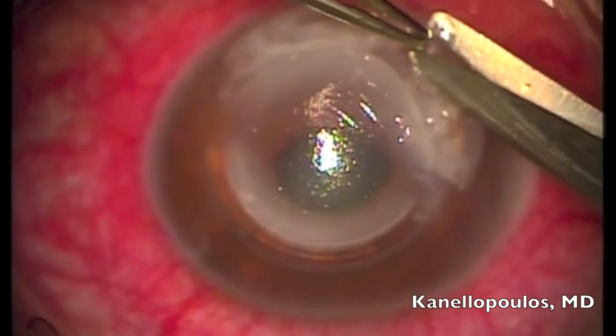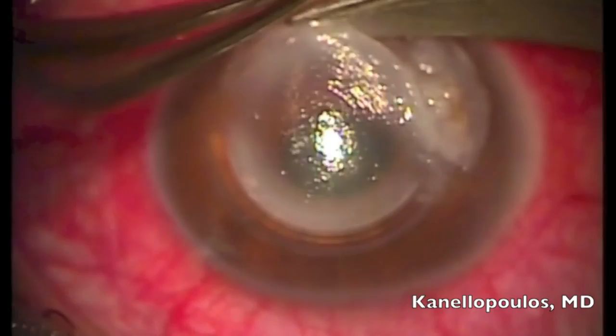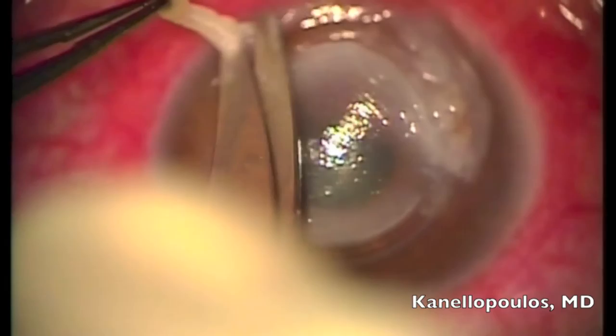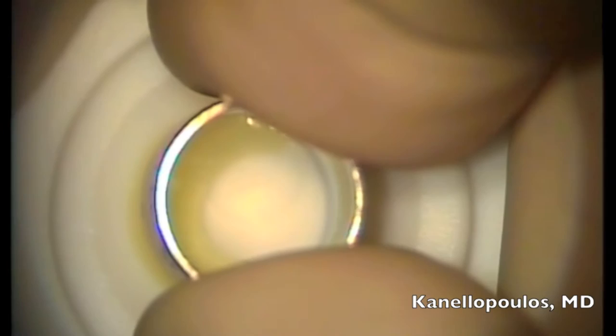Before placing the glue, we had removed the inferior horizontal INTAC. You can see how initially it was placed elsewhere in Greece — this was 16 years ago. It was placed slightly eccentrically to be inferior to the central pupil, so probably centered around the cone. We're left with basically a very thin stroma layer in Descemet's.